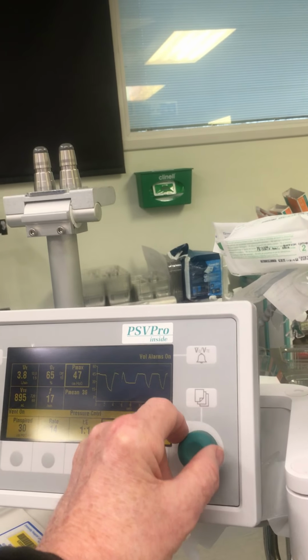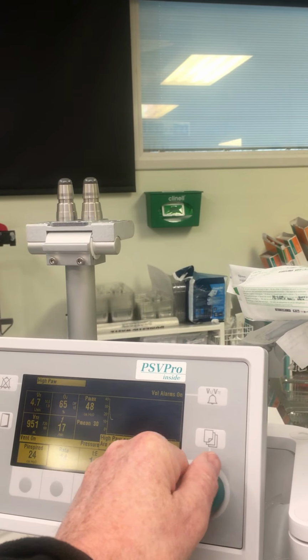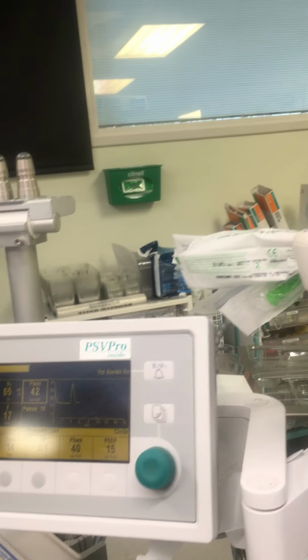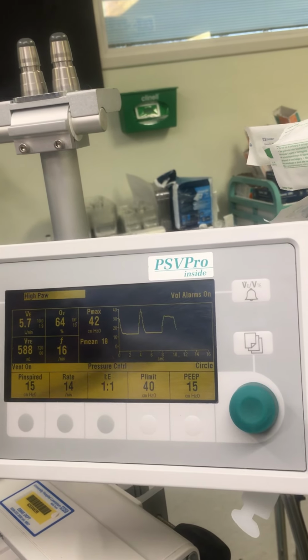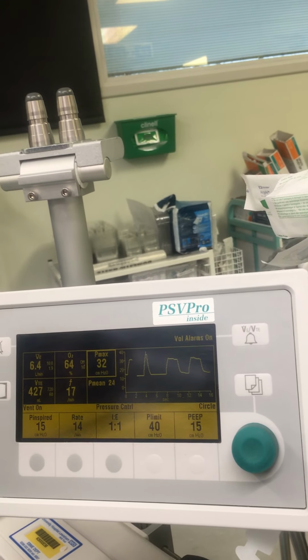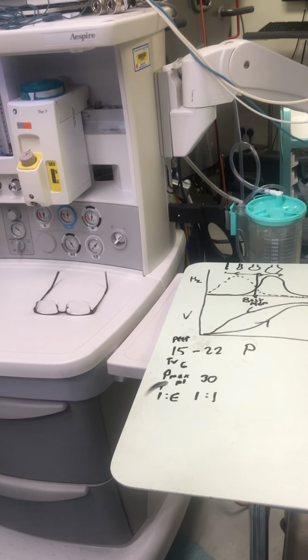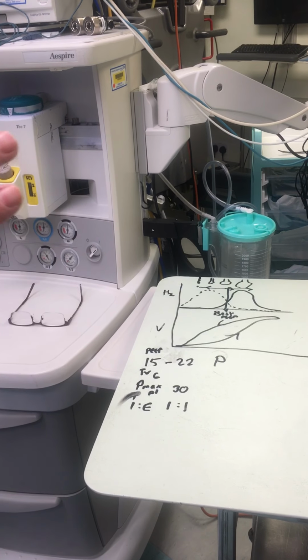The P inspired, isn't that on top of the PEEP? Sorry, you're right. Yes, it's going to be 15. Beg pardon, 15. Now, the difficulty with that, of course, is the mean airway pressure. If you do that, the mean airway pressure will be relatively high. So you may have concerns about squeezing the mediastinum by doing that, and you may find that they get a bit wibbly in terms of blood pressure.